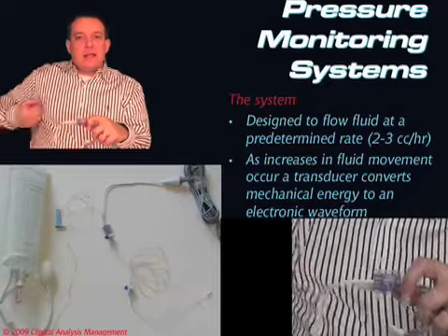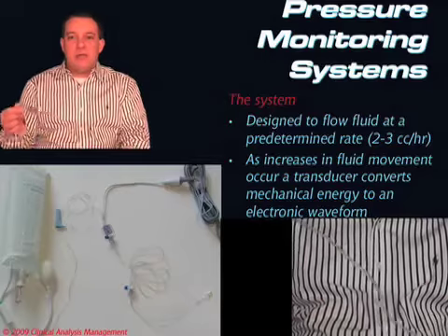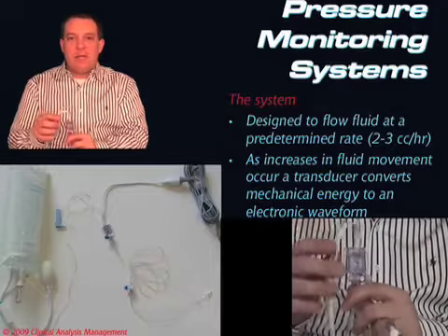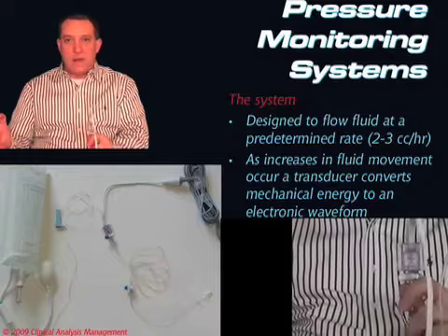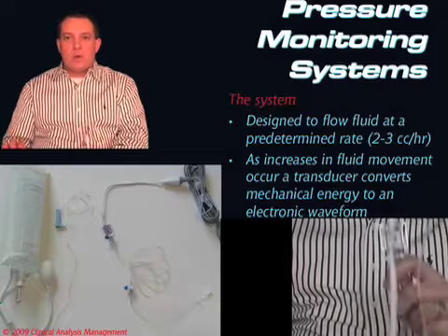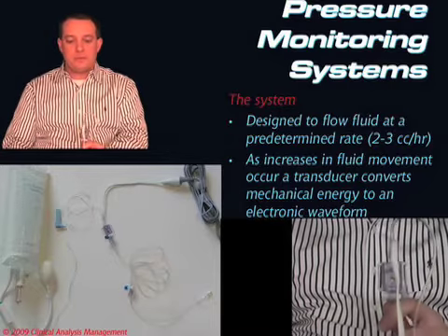If we can't get to that, let's say it's a spinally immobilized trauma patient, then we can also just tape it to their bicep. And in the ICU, because we have nothing better to do and we like to make our lives miserable, we'll take this and slide it into a slot on the IV pole, and then we'll take a balancer or a device that allows us to see that things are equal, and we're going to equalize it, make sure that it's where it's supposed to be and that it's equal with the patient's right atrium.